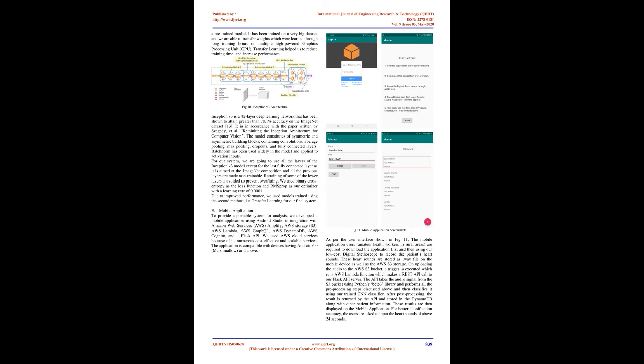Max pooling layer 1, 2, and 3 pool size equals 3x3. These layers are used to reduce the spatial size of the feature maps so that the computational power required for processing is reduced. It is also useful for extracting dominant features, i.e., positional and rotational invariance. Max pooling returns the highest value from the part of the feature map covered by the kernel. Since max pooling also discards the noisy activations and performs denoising in addition to dimensionality reduction, it is better than average pooling. Convolution layer 2 and 3 are the same as the first convolution layer, with the only difference that the number of kernels equals 64.